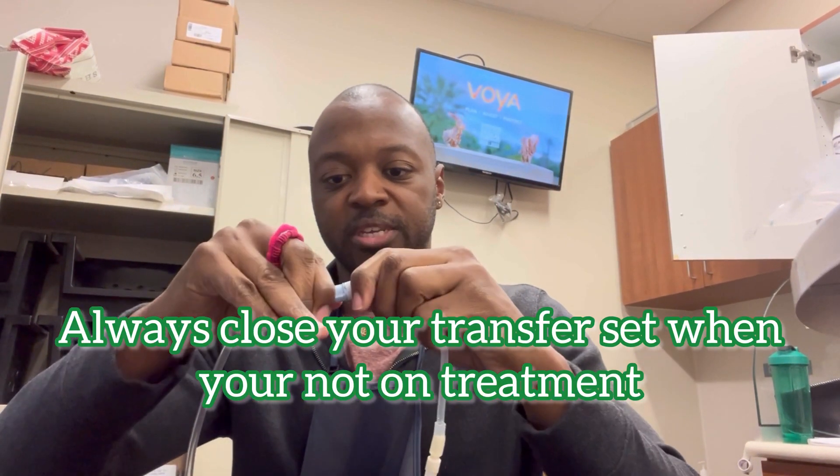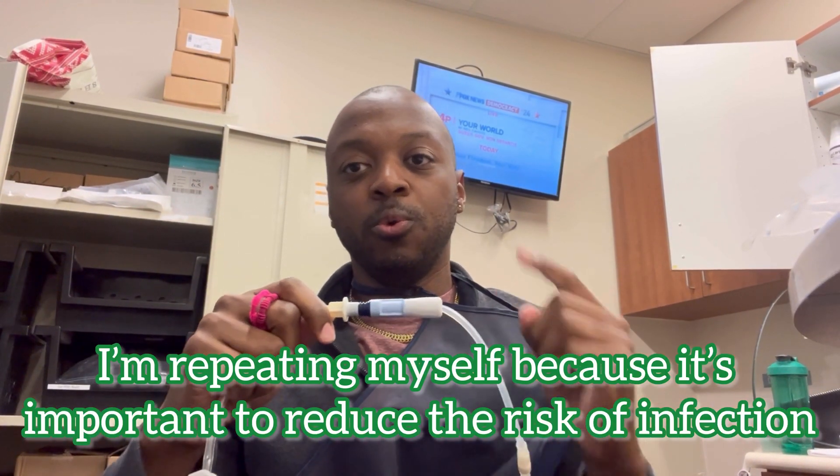I'm connected to the machine and the machine's draining. I pressed the stop button to stop the program. The first thing I'm going to do is close my transfer set, because I'm not doing anything with the machine right now — better safe than sorry, especially since I know I'm about to disconnect. So after you close, you do the one-minute scrub and one-minute soak. You always do this before you disconnect.